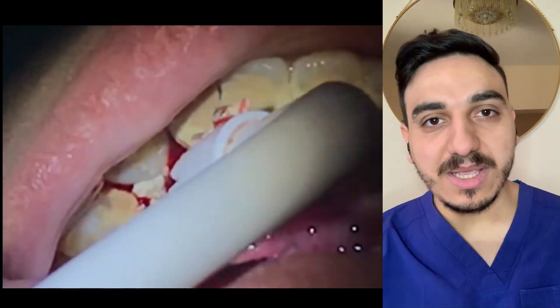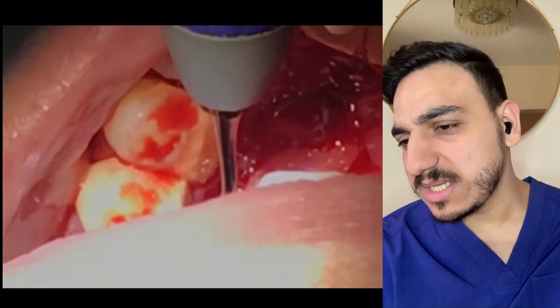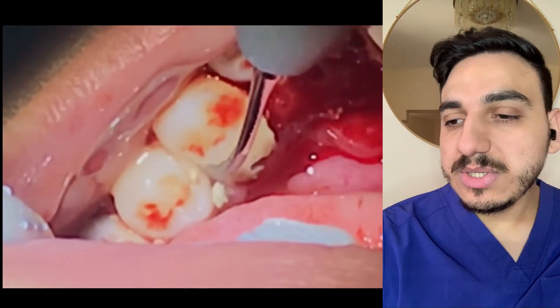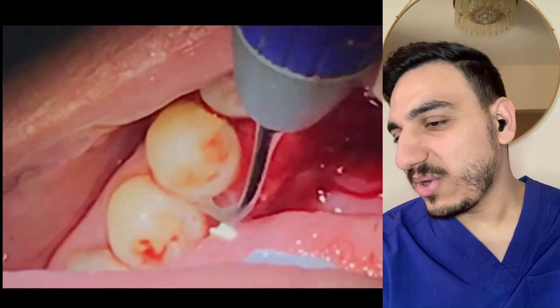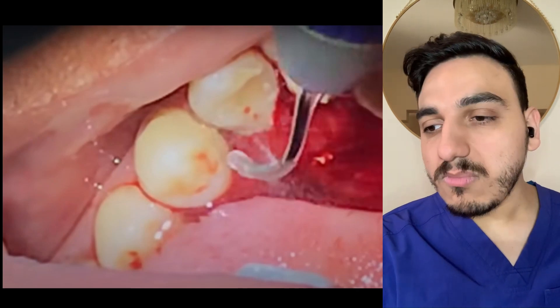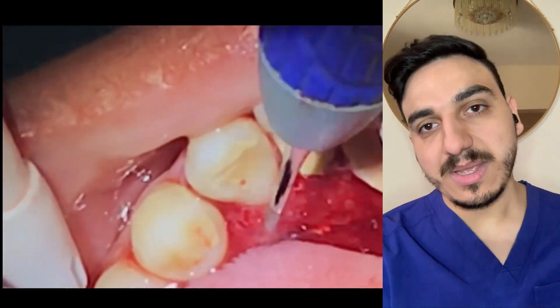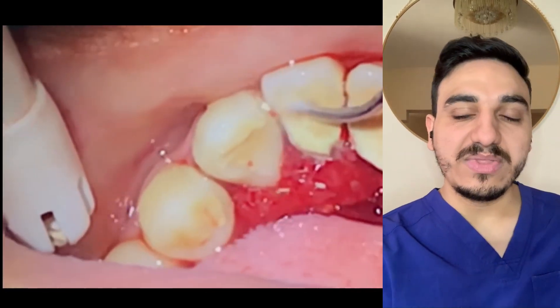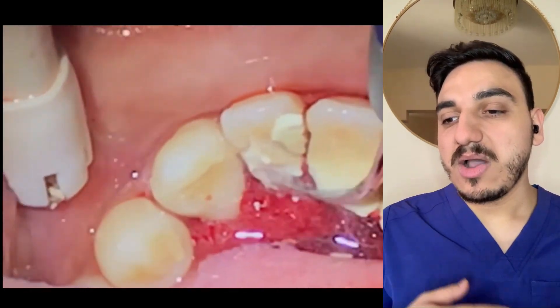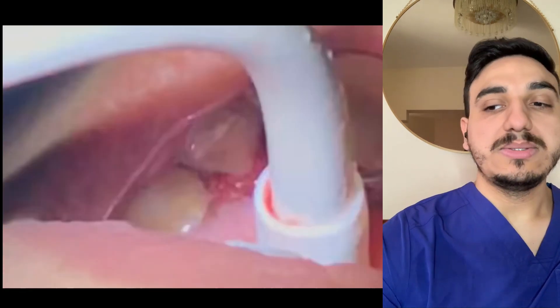This looks like a really bad, severe case — this is probably one of the heaviest calculus deposits I've seen. A lot of people during a dental cleaning may ask why there is bleeding. Well, because the gums had been inflamed underneath all of these calculus deposits, and as soon as we remove them, the gums are going to be inflamed and very highly prone to bleeding.